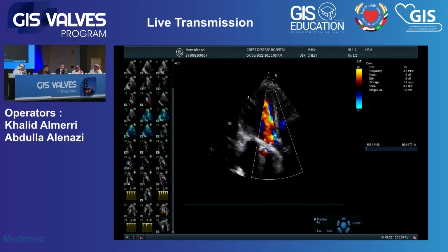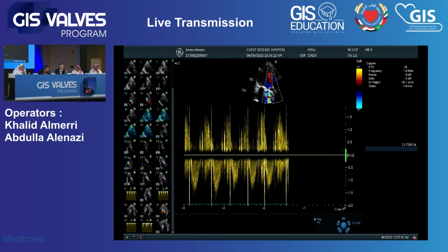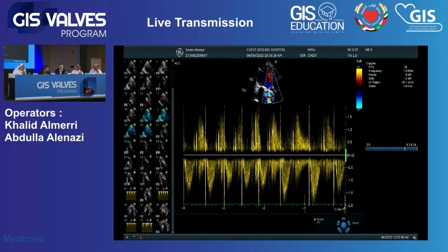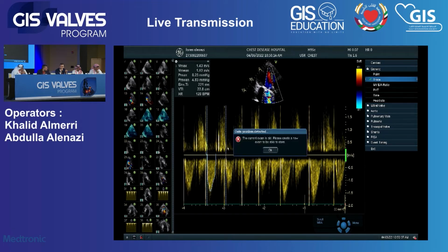Albert? I think there are 2 ongoing trials now looking at cerebral protection. Indeed, we're all looking forward to seeing those results. And as they always say, at this stage I think the consensus is it's better to be in the basket than to be in the brain. I think we all agree on this one. And Sentinel is a simple device. It can be deployed within a few minutes, safe, no side effects. In this particular case I'd agree that using the Sentinel is wise.